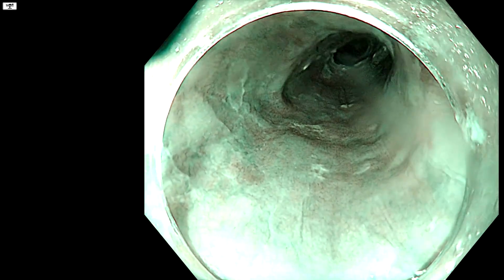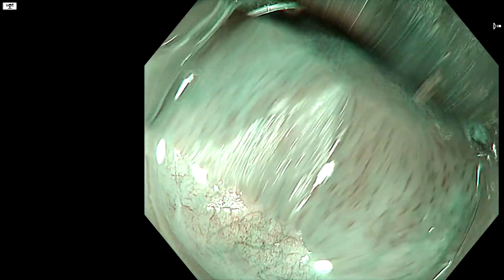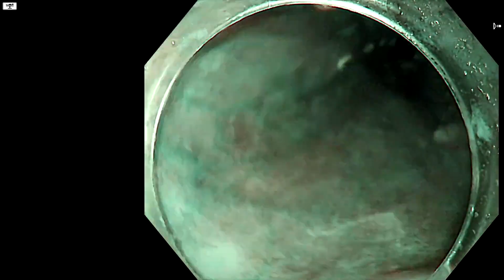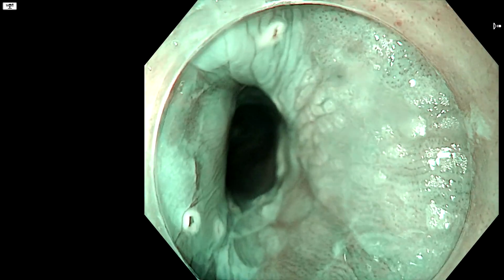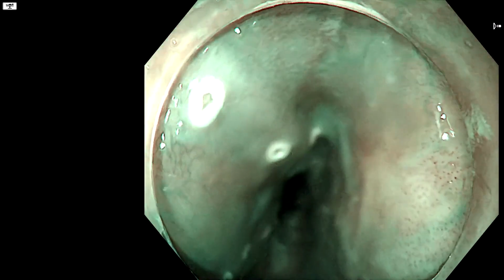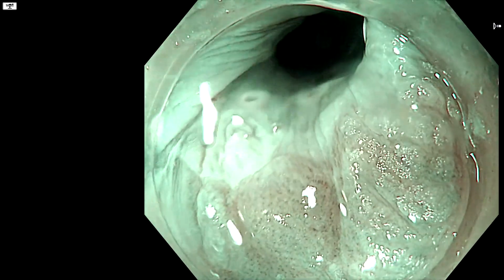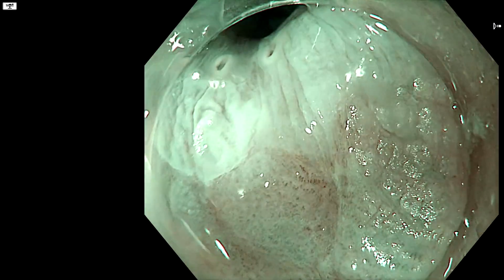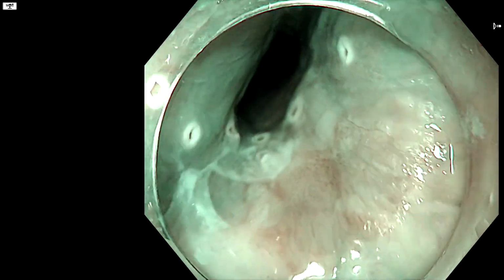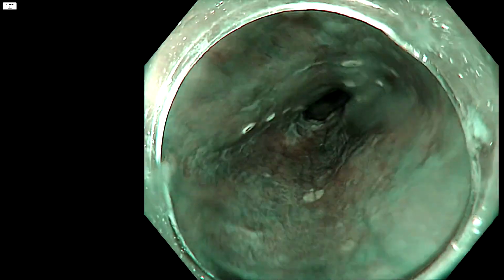If we just look a little bit at the IPCL pattern here, for sure it's not normal. It's also not highly abnormal when you compare it to what we're seeing in some areas around here. And we'll see if we can find a part of it for you to have a look at. We'll also see some abnormalities here in this zone. We inflate a bit. But for sure we have slightly dilated loops. They're going in a different direction.